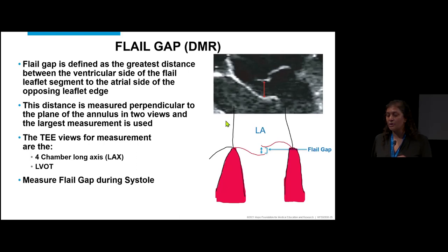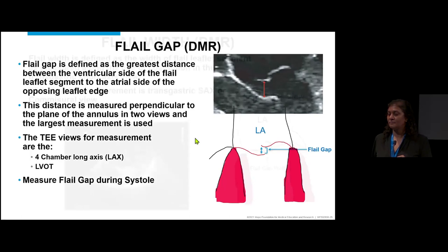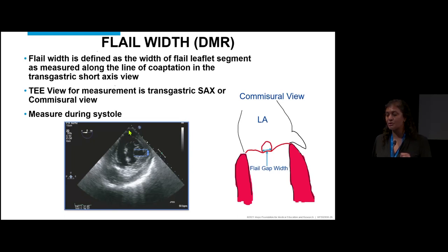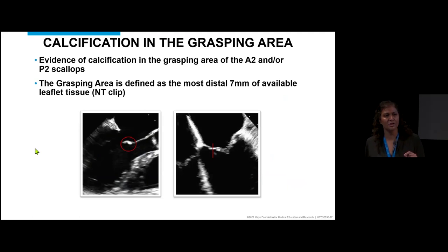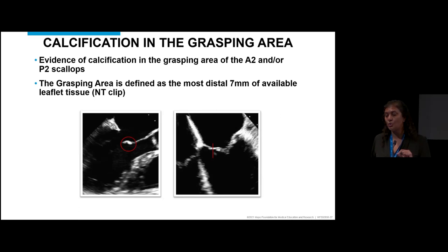The flail gap is measured from the long-axis view during systole — that's where the MR jet takes off. Flail width can be measured from the transgastric short-axis or the commissural view. Calcification is also important — we're grabbing the leaflets, so calcification where you're grasping won't take well to the clip arms. We look at the distal 7 mm of both A2 and P2 for calcification; on TEE it can be difficult to differentiate calcification from valve thickening and fibrosis.